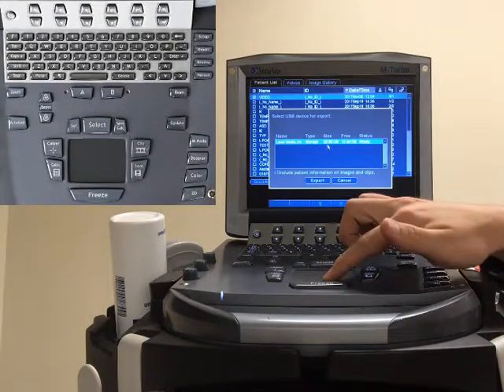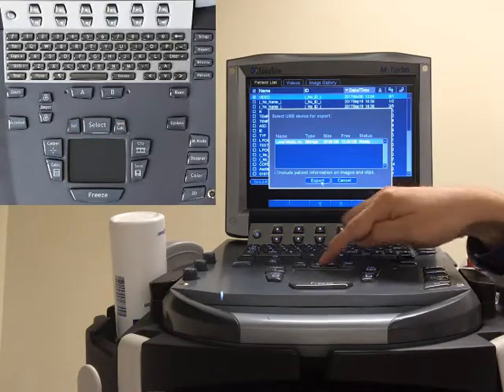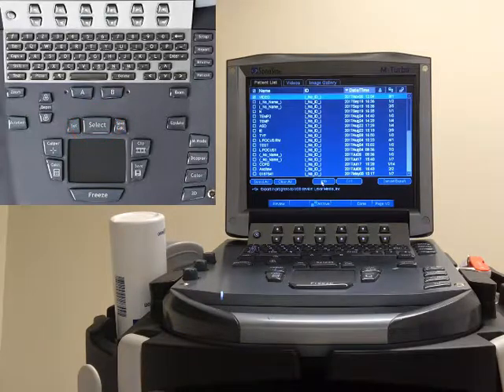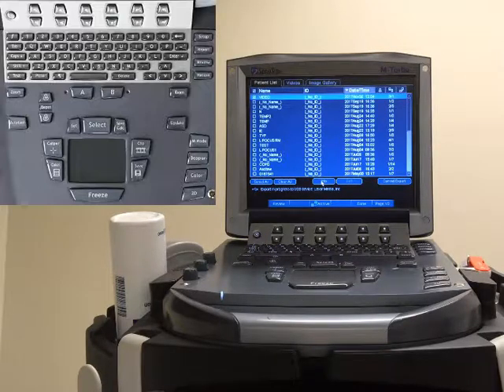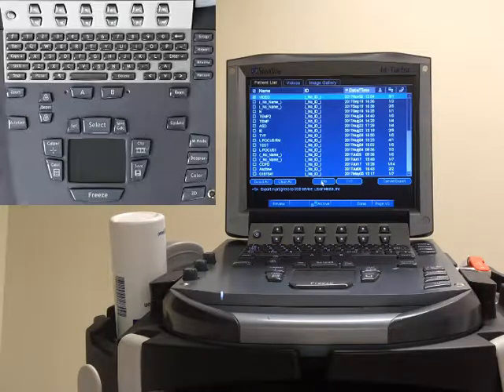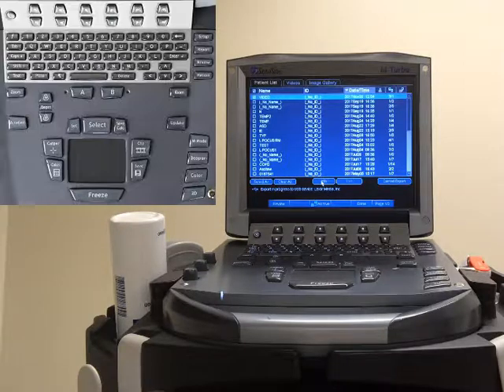Select it again with the trackpad or arrows and the select key, then highlight export. It tells you that the export is in progress, and once it is finished exporting that line will disappear. Unfortunately it can take time, even for this study with two simple JPEGs and one short AVI. And now it is successfully exported to the USB key.